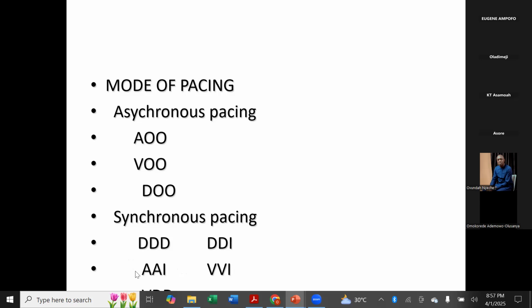When the patient goes into sinus bradycardia, the AAI mode kicks in and is going to follow the normal intrinsic activity of the AV node and the ventricle. Okay? That's just the benefit of an AAI mode.